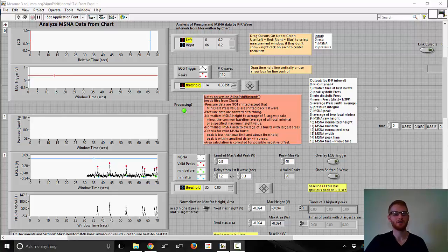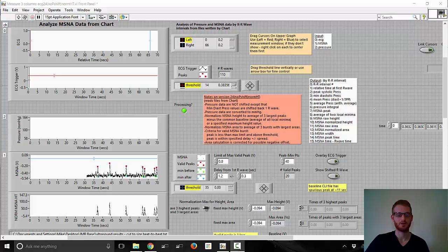I'm going to try to explain here how to do cardiac vagal baroreflex analysis as well as heart rate variability analysis.